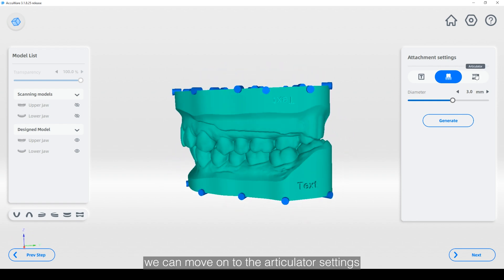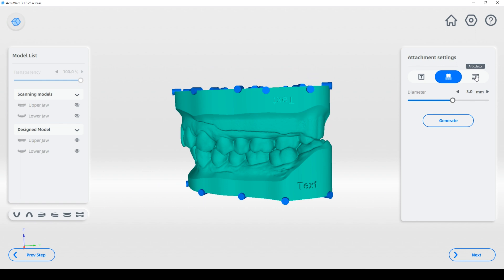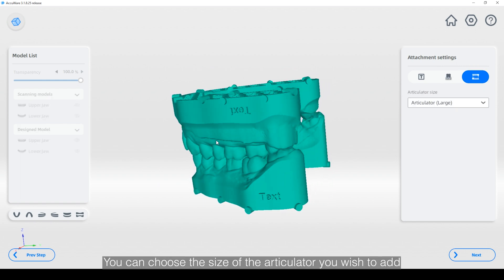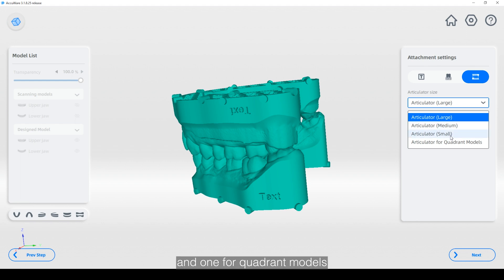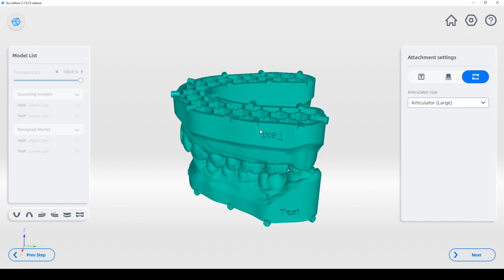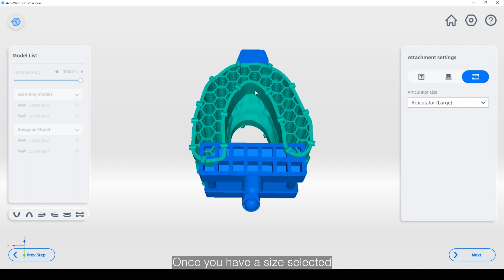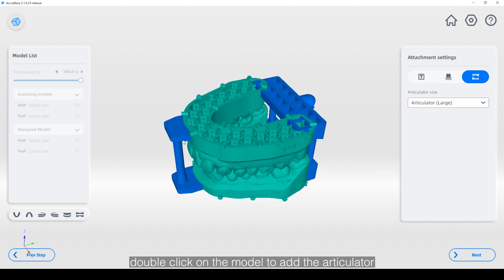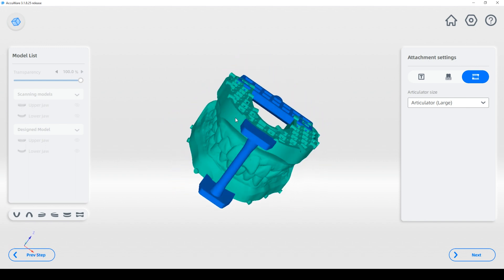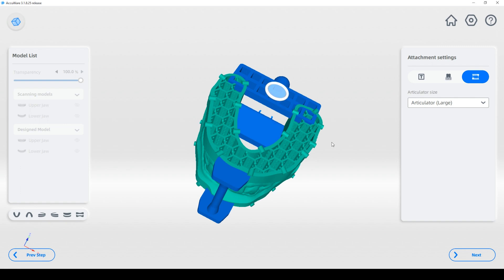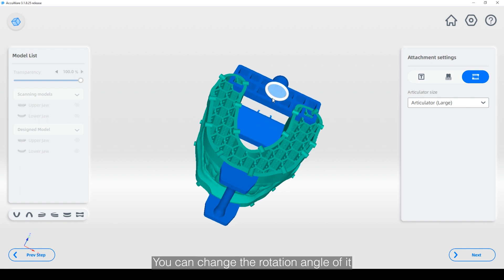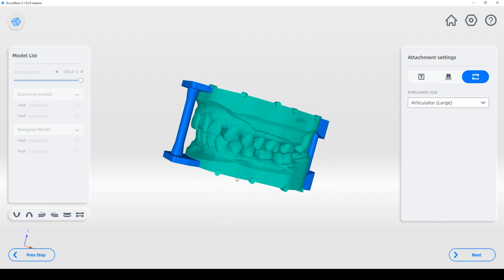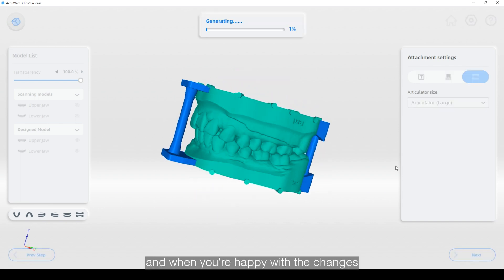Once you're happy with that we can move on to the articulator settings. You can choose the size of the articulator you wish to add — large, medium, small, and one for quadrant models. Once you have a size selected, double click on the model to add the articulator. If you click on the base of the articulator you can change the rotation angle of it, and when you're happy with the changes you can hit next to generate the final model.